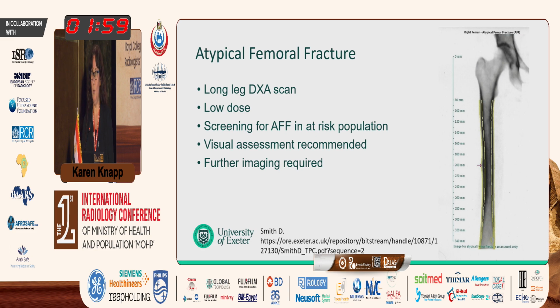These have a high morbidity rate associated with them, and they always require a femoral nailing. But actually, because they are very difficult to get to heal, a lot of repeat surgeries occur. Many hospitals will undertake prophylactic femoral nailing because the risk of these going completely is catastrophic for the patient. The software for these is not as accurate as actually doing a visual assessment, but again, further imaging is required.